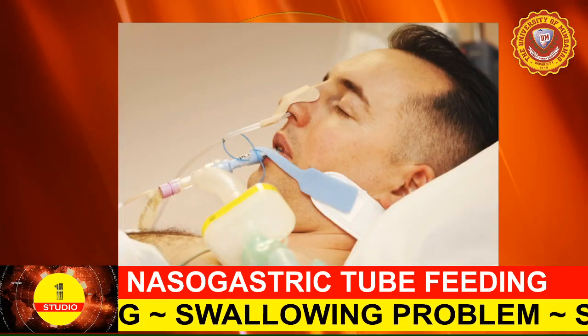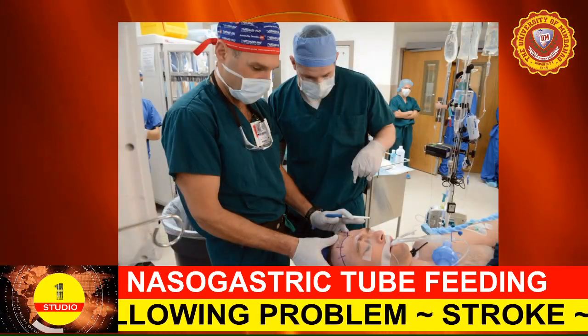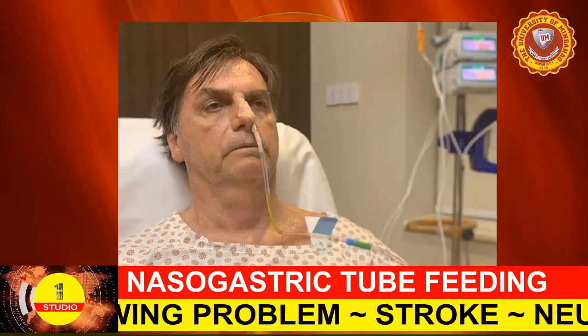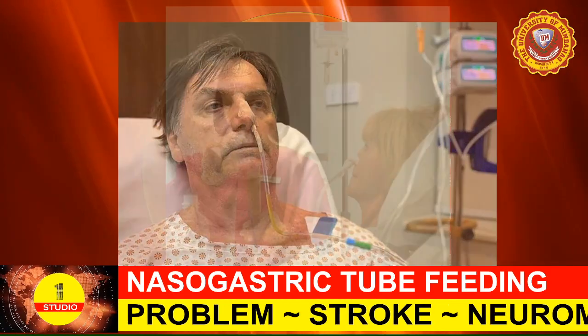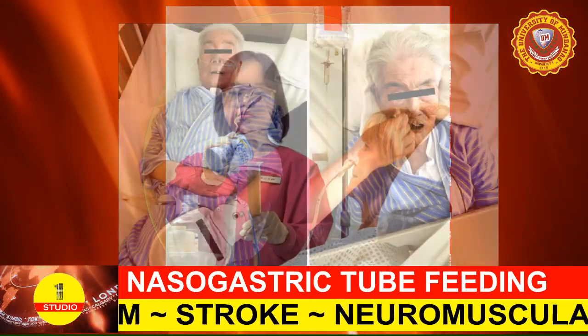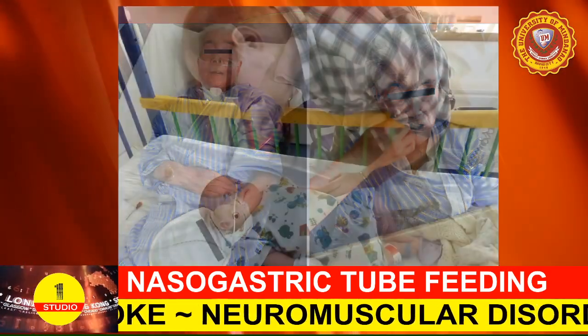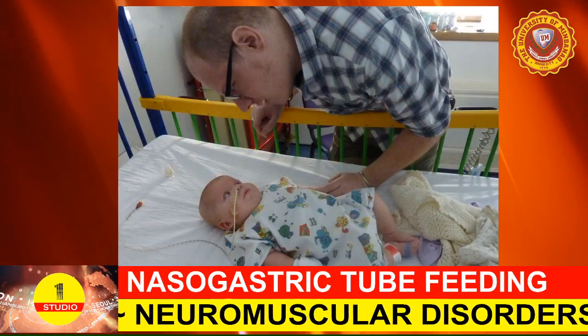Nasogastric tube feeding is indicated for clients with swallowing issues in cases of stroke, neuromuscular disorders, critically ill clients on a ventilator, vegetative state, and/or coma.